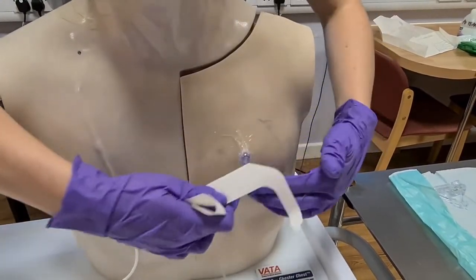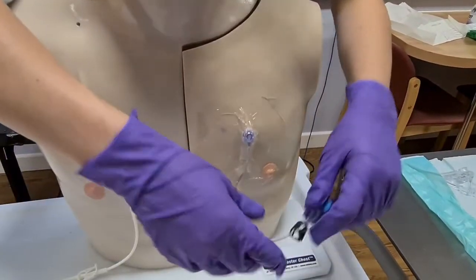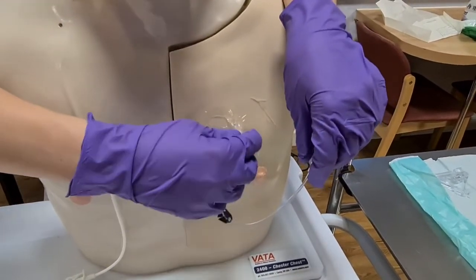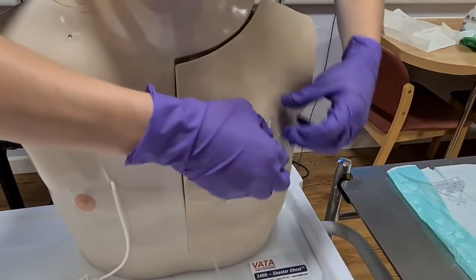There we go. So the line and the dressing need to be changed every week. You know that you're in the right place because you can aspirate blood and you can flush it well as well. So to remove the line, you remove the dressing.